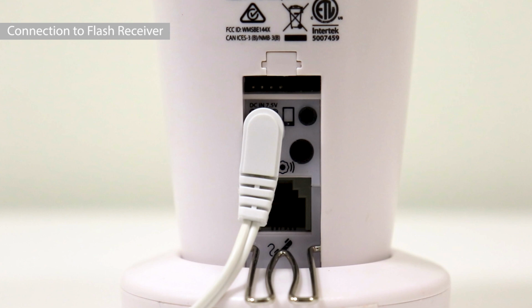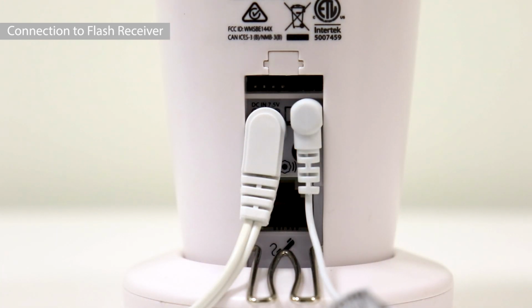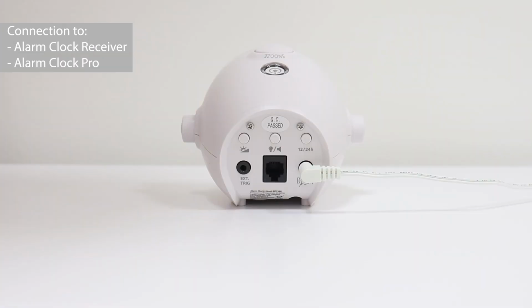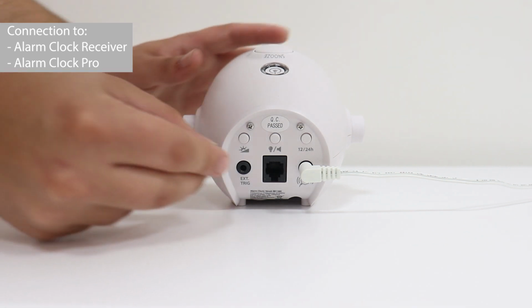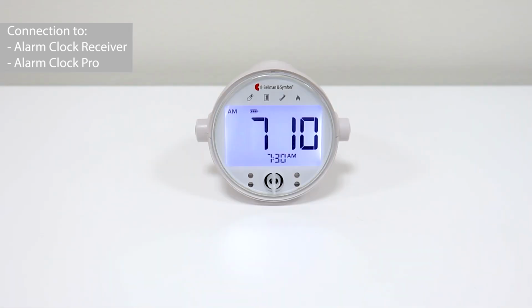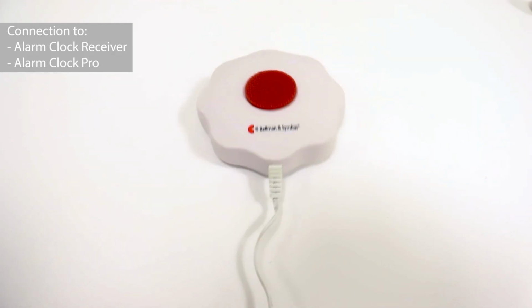To connect the mobile phone sensor to the flash receiver, plug the 2.5mm jack into the mobile phone sensor port on the back of the flash receiver. When you receive an incoming call or notification on your cell phone, the flash receiver will notify you with bright flashes. To connect the mobile phone sensor to the alarm clocks, plug the 3.5mm jack into the external trigger port. Whenever you receive an incoming call or notification from your cell phone, the alarm clocks will notify you with sound, flashes, and vibrations from the bed shaker.